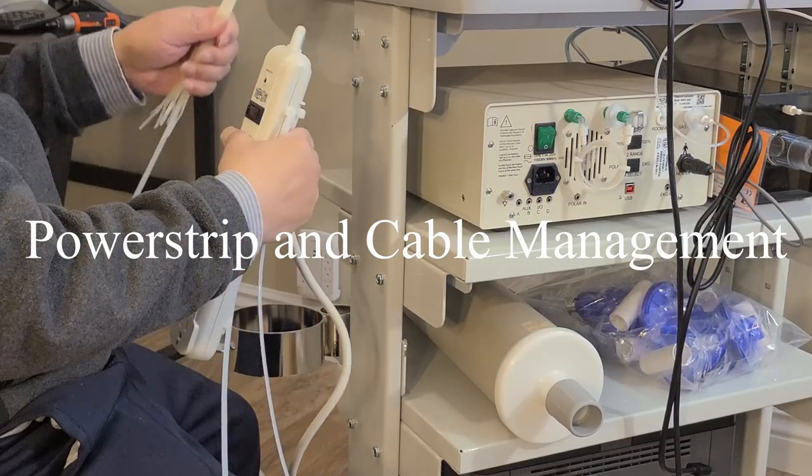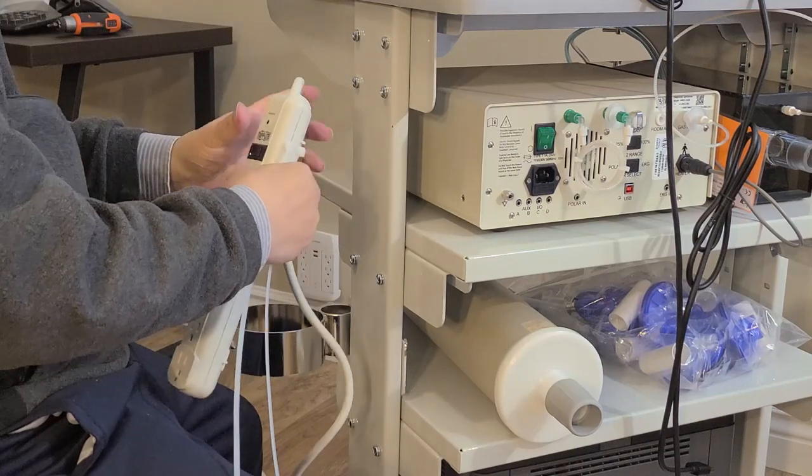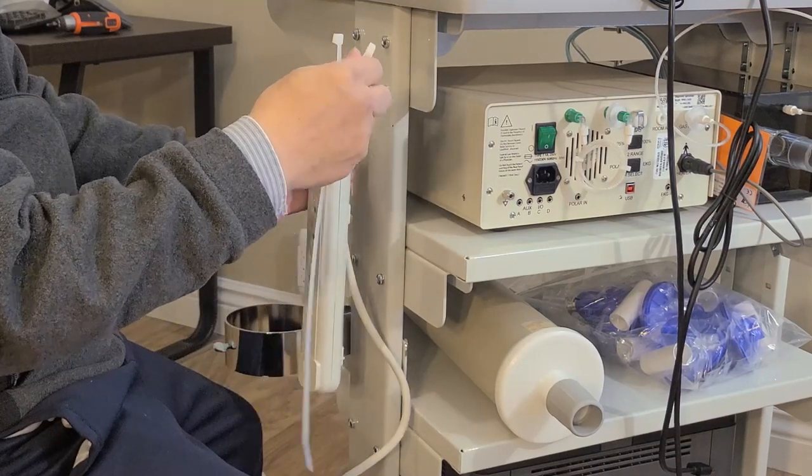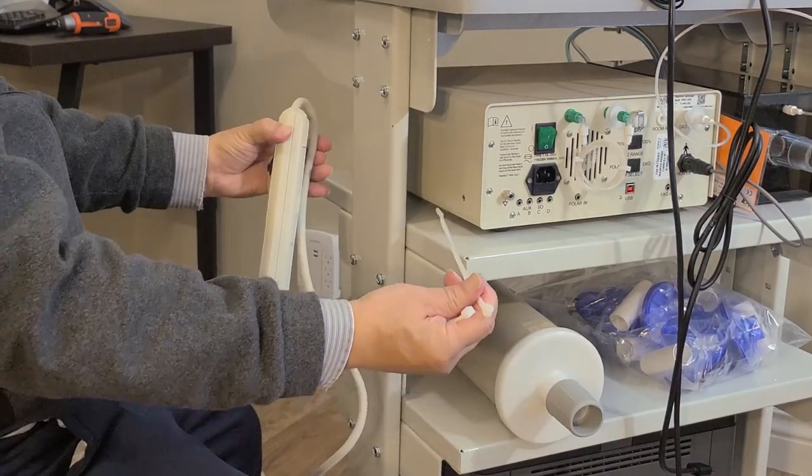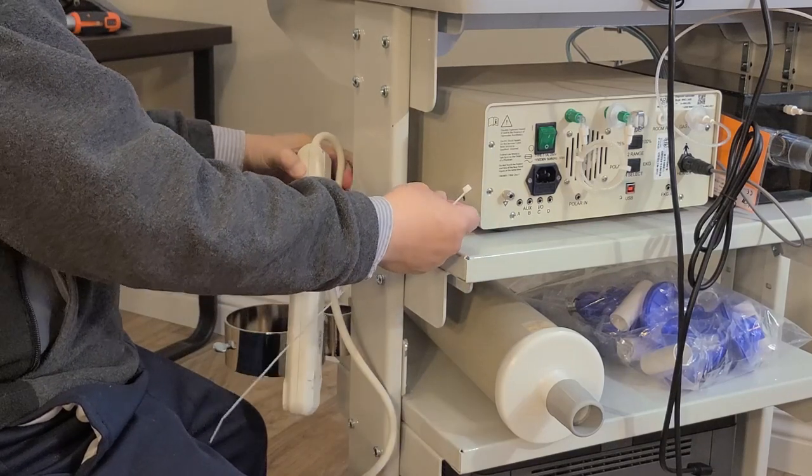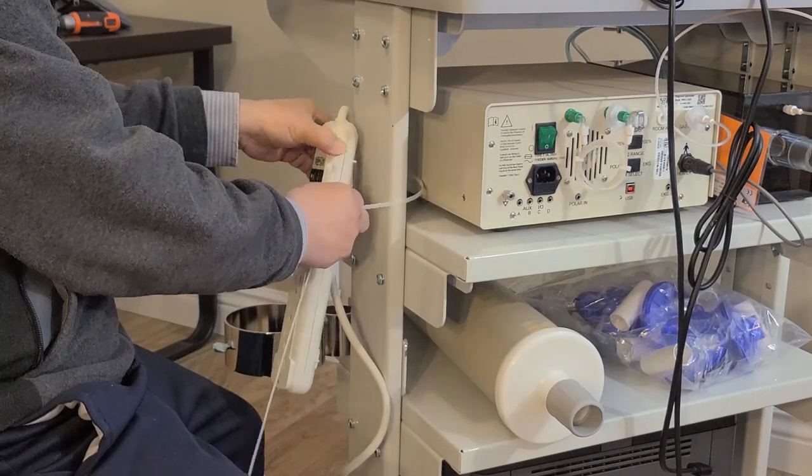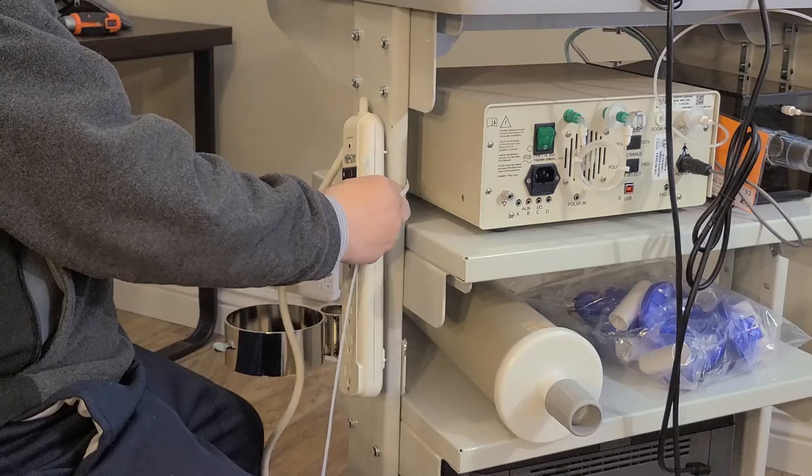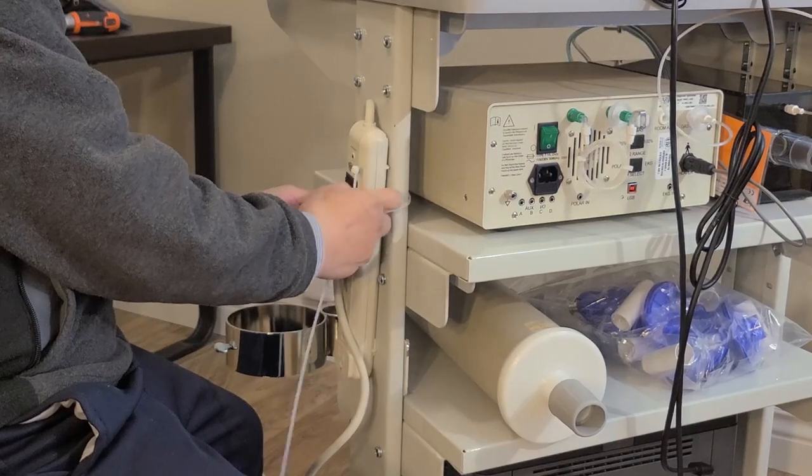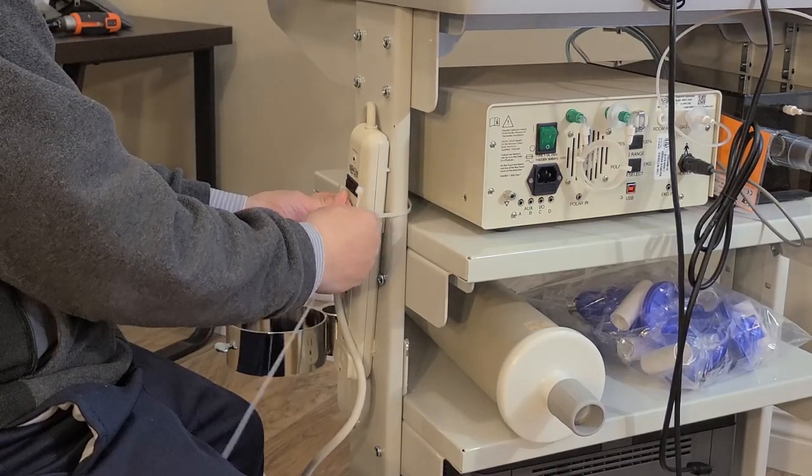Next, we are going to tie the power strip on the side panel. You find the longest nylon tie and you tie it right under the power strip.